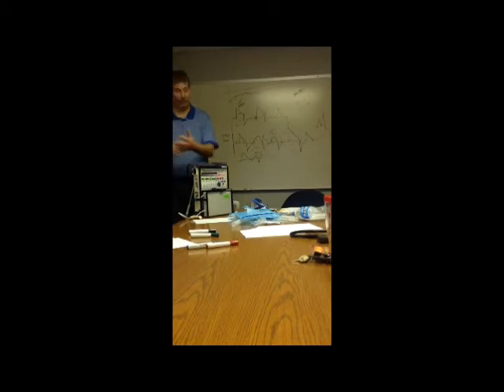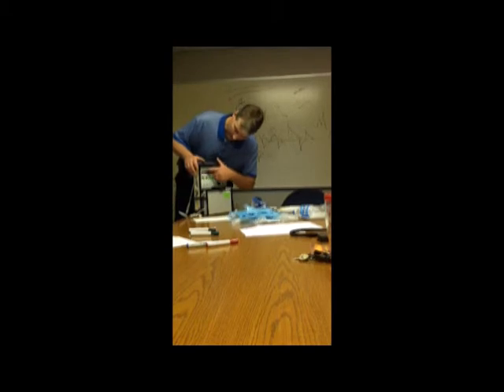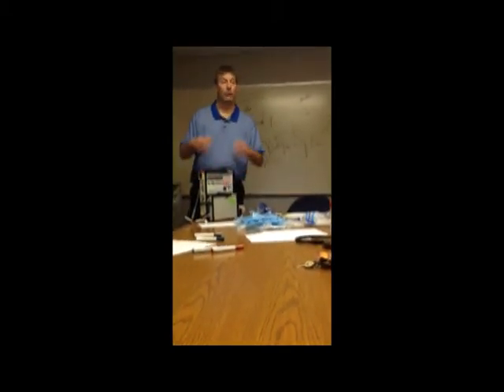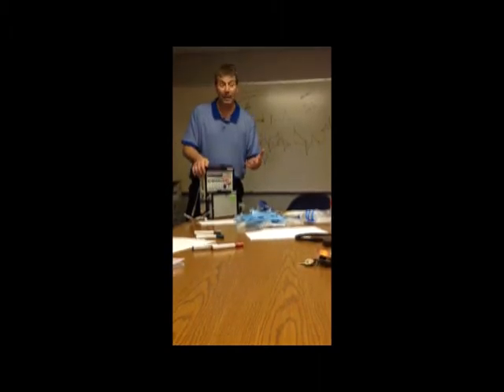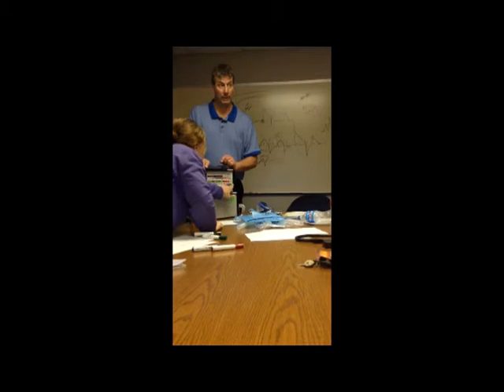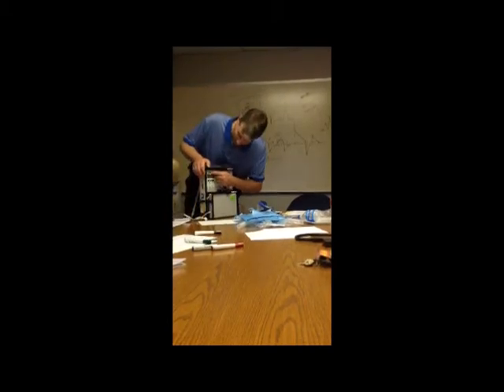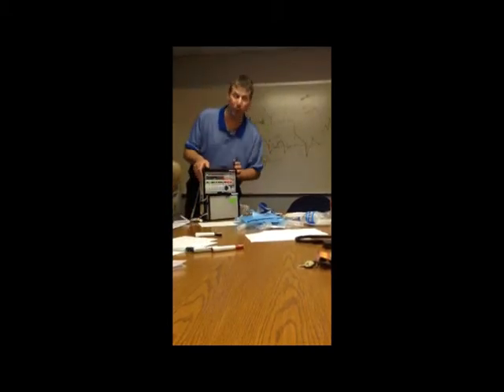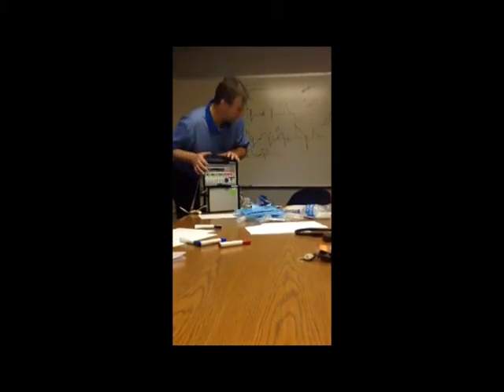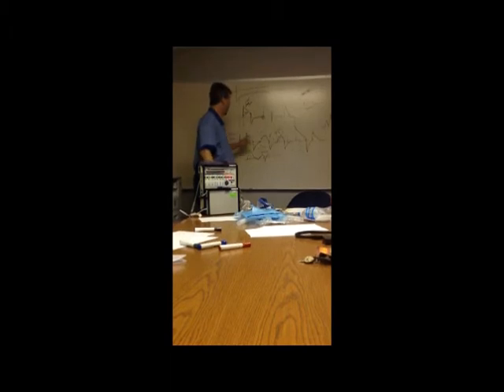If you're getting a patient with higher tidal volumes than you think's good, what would make me decide to cut it down and start changing things away from where I was, where I had to compensate and all that? Peak pressure. They're getting 700 and their peak pressure is 40, you're overstretching them. They're getting 700 and their peak pressure is 10, then most likely they're sucking in real hard and they need that volume. Does that make sense? And you can always see the peak pressure right here, breath to breath. You can know real quick.